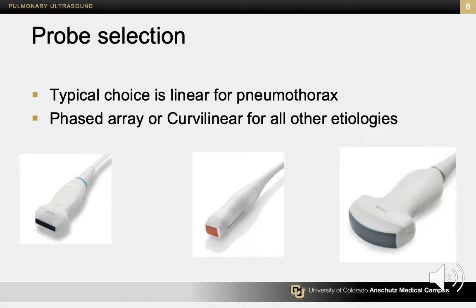So a little bit on probes, using the Butterfly right now. So obviously we don't have a probe to choose from, but we do have different presets on the Butterfly probe. So we have a pulmonary preset, which is what we'll be using primarily for this scanning session. Just adjust the presets a little bit so we have better definition where we need it.